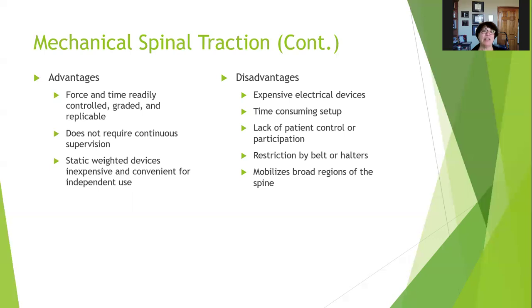There are some static weighted devices that are inexpensive and they say convenient for home use, but some of them are such weird setups. I don't know how people would do them at home. But there are other ways to do traction at home, and we'll look at them really quick.